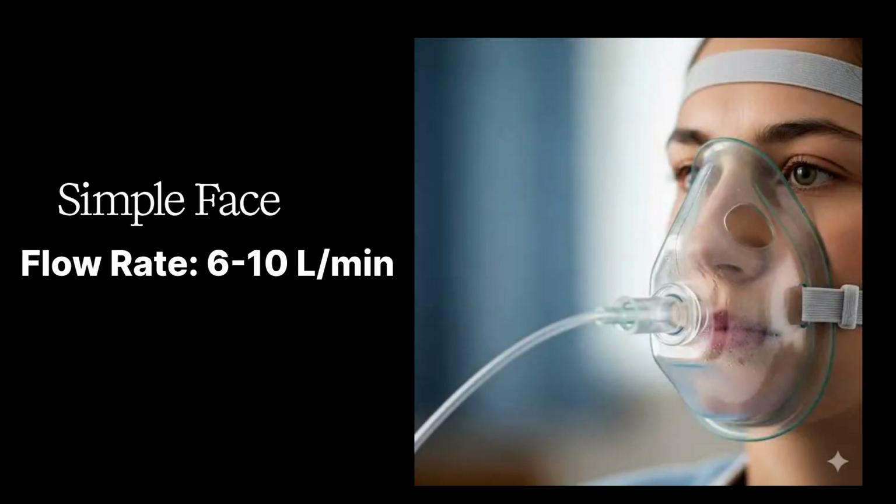Simple face mask, a mask that covers the nose and mouth. Flow rate 6 to 10 liters per minute. Consideration: this makes it difficult for patients to eat, drink, or talk, so you'll need to remove it for meals.